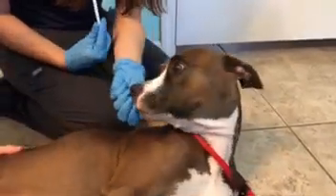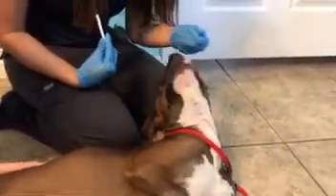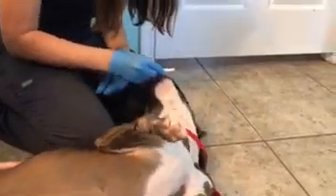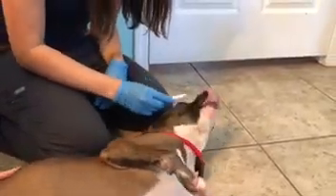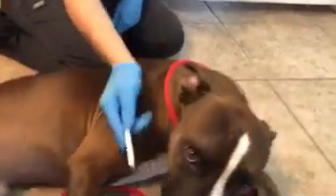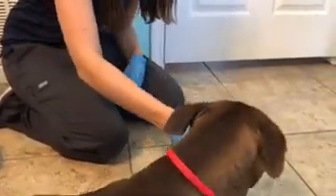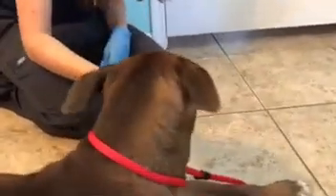And then again, sometimes I'll go back and forth. Sometimes I'll try to create this anticipation with the treat, so there's some salivation. And regardless of whether it's the pre-play group saliva or the post, you can give the dog its treat right after the sample. So again, it needs to be about 10 minutes, the cutoff between treat and saliva sample.